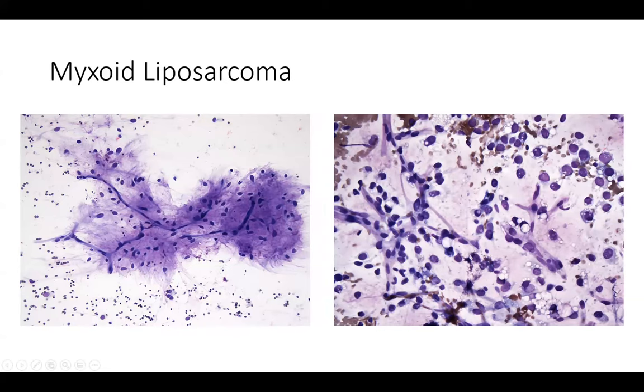So here you can see this large myxoid stromal fragment with that really characteristic chicken wire or crow's feet, thin-walled vascular pattern investing the stromal fragment, and these uniform ovoid to spindled cells embedded within there. When the lipoblasts are present, it's a little bit easier to make the diagnosis. And I mentioned before, these lipoblasts are small. Here's a univacuolated one. Here are ones that have smaller vacuoles and that are multivacuolated here. And again, that telltale vascular pattern.